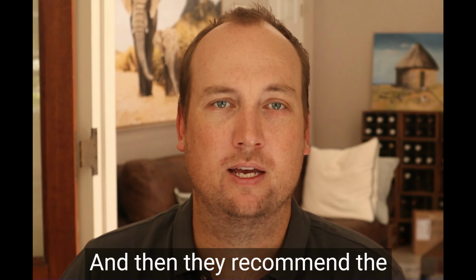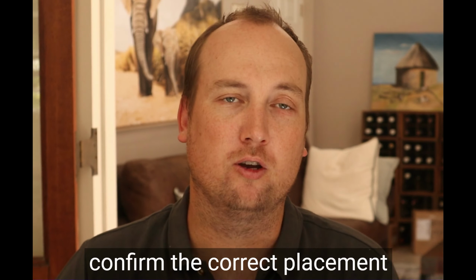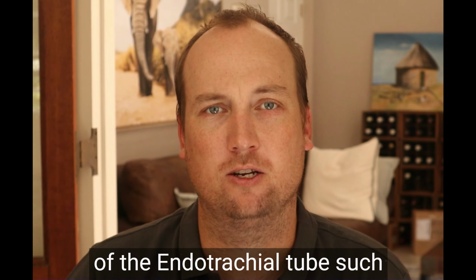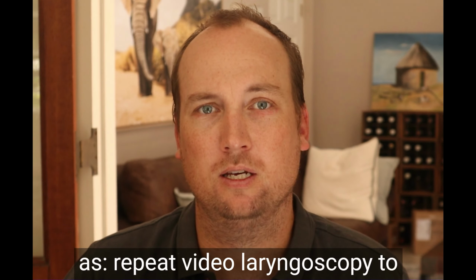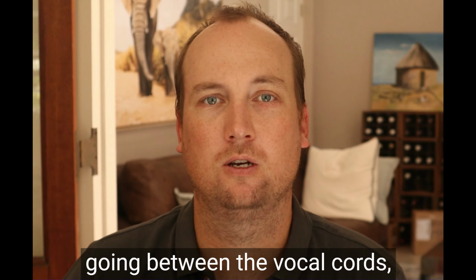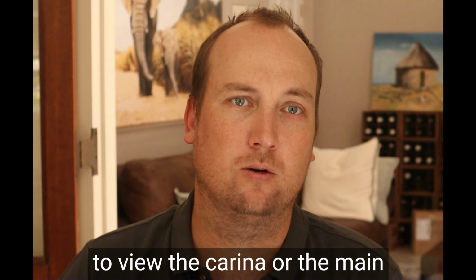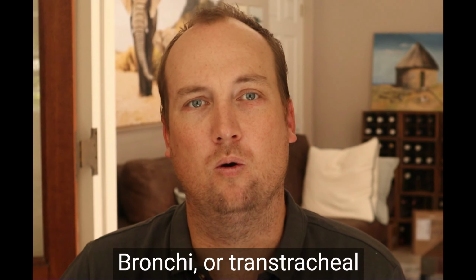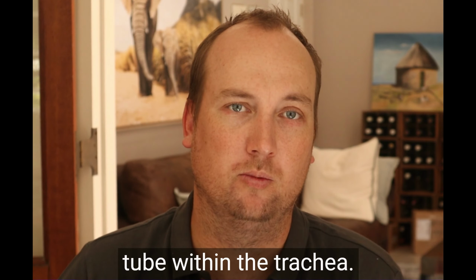And then they recommend the use of other aids at this point to confirm the correct placement of the endotracheal tube, such as repeat video laryngoscopy to confirm that the tube is actually going between the vocal cords, or fiberoptic bronchoscopy to view the carina or the main bronchi, or transtracheal ultrasound to view the endotracheal tube within the trachea.